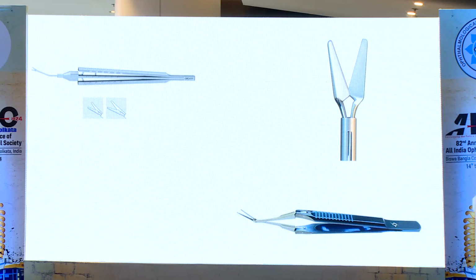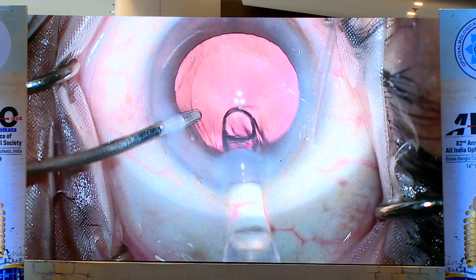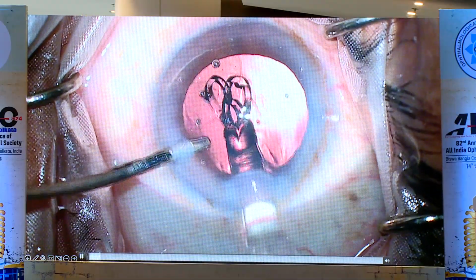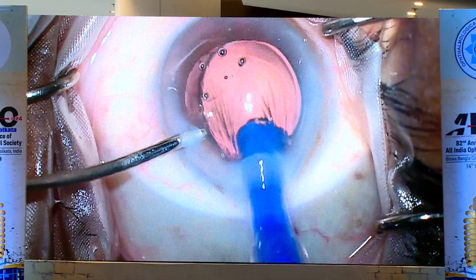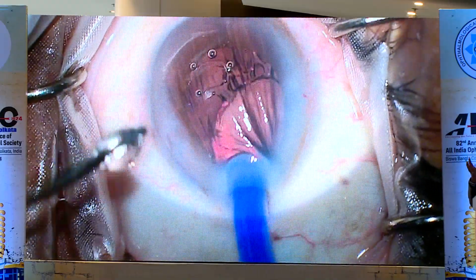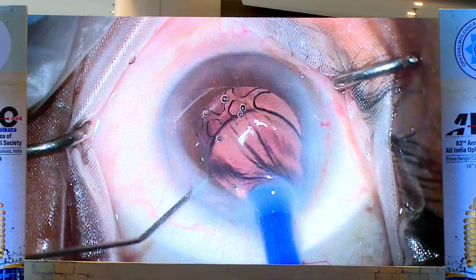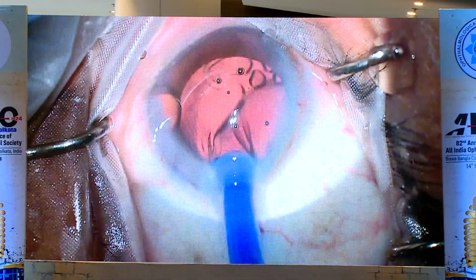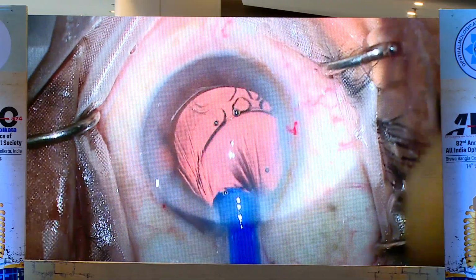You develop one technique and stick to it, though sometimes you need a different cutter. I am showing my snare technique, which I developed in 2009, for explanting the IOL. This is how the mishap happened. I am implanting under irrigation a Mini Well Proxa lens, and suddenly it got stuck. The lens haptic was so long, and it is a hydrophilic lens. I cannot inject, so I injected OVD from the left hand side port, but I am not able to implant the lens, and there is a struggle.